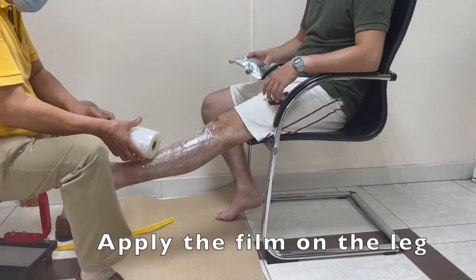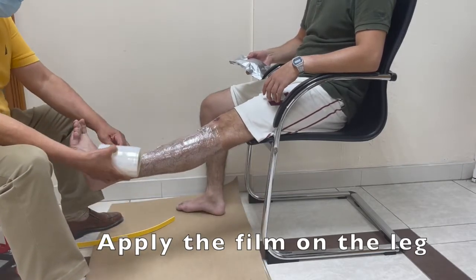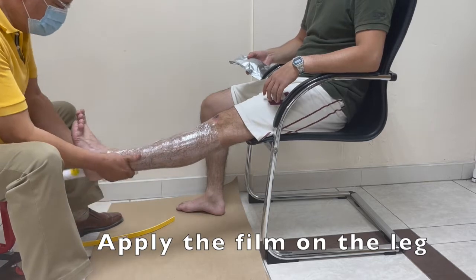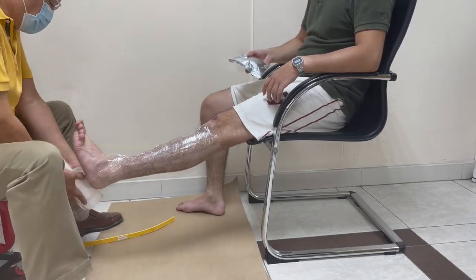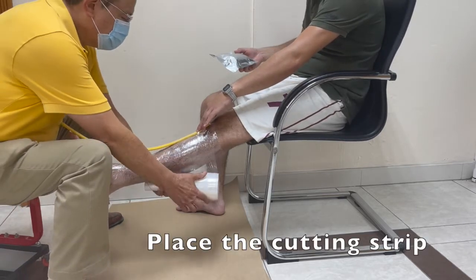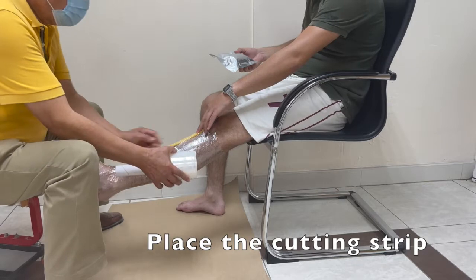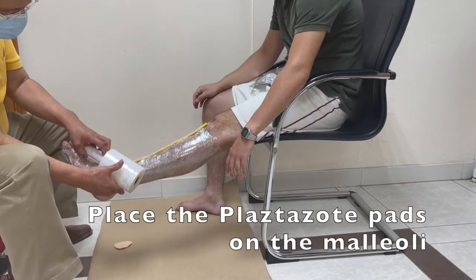Hola. It is a great pleasure and a great opportunity that I have been using this new C-Form tube in order to cast lower limbs, not only for orthotics but as well as for prosthetics. You will see during the video it's so practical, so easy to take a cast.